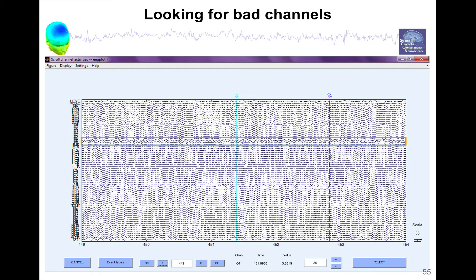There is no universal method for cleaning EEG data, so you'll have to look at your data and familiarize to what kind of artifact some method removes, and what are the true artifacts you would want to remove.